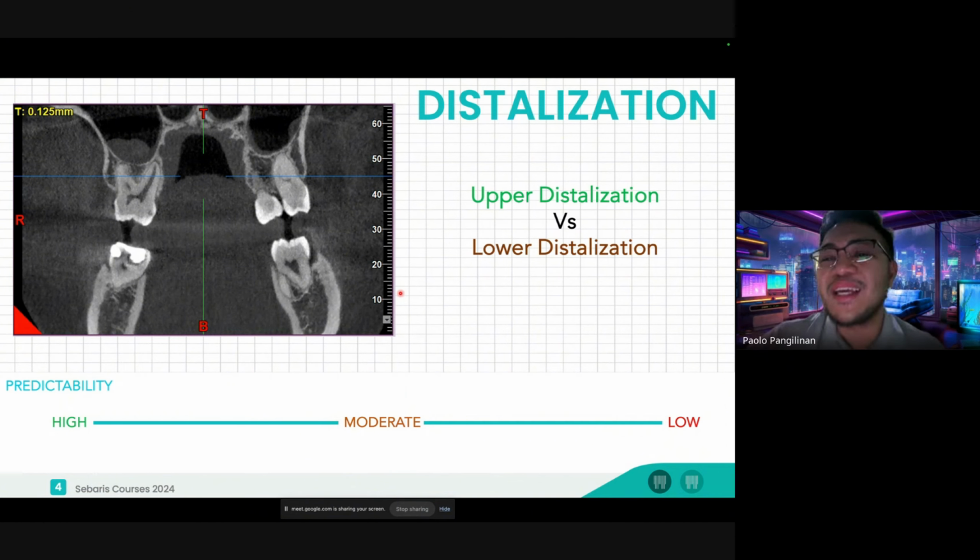Now, the way I look at digital orthodontics or digital dentistry as a whole, it's still dentistry, it's still orthodontics. We just made it digital. We just made it on a simulation. Whatever you see on the simulation is just a mere simulation. It's not going to represent what's going to happen inside the patient's mouth, but it shows you the objective. Okay, let's get that right.